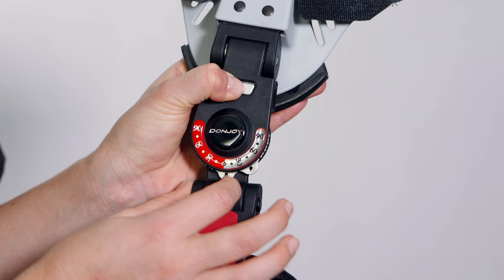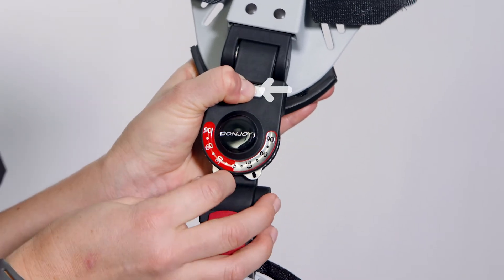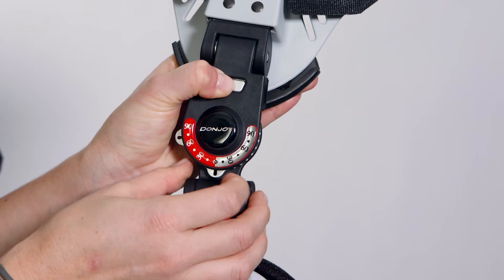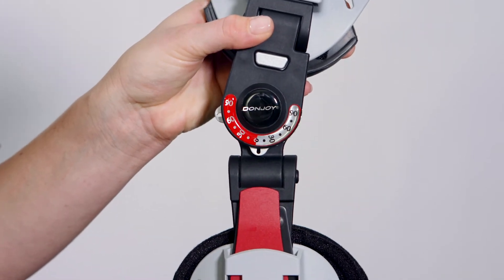Prepare the pelvic shell and hinge assembly for placement. Set the range of motion hinge by pressing the center button on the face of the hinge and moving each respective tab to the desired positions. Note: make sure the center button returns to a fully locked position — a click sound may be heard and the center button protrudes when locked.